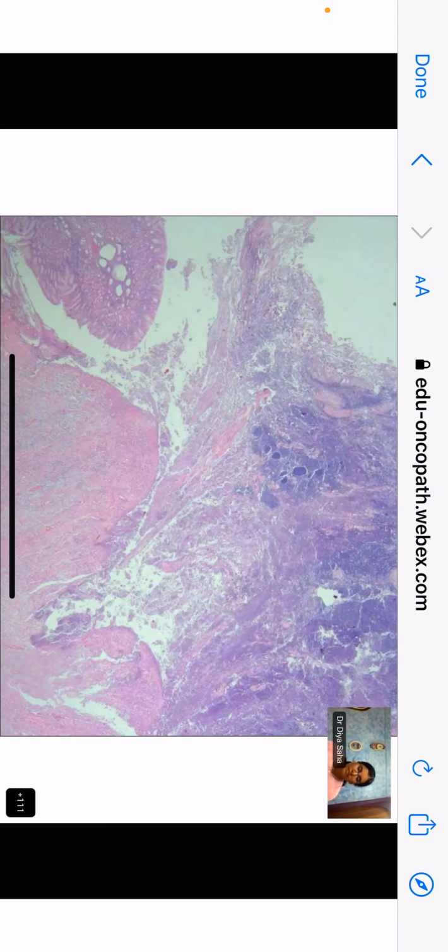Come on, Dia. Ma'am, I can see the mucosa, which has those gastric pits, and below them there are mucous glands, which are focally dilated. Once again being irrelevant, okay? Are those the observations that one needs to make?